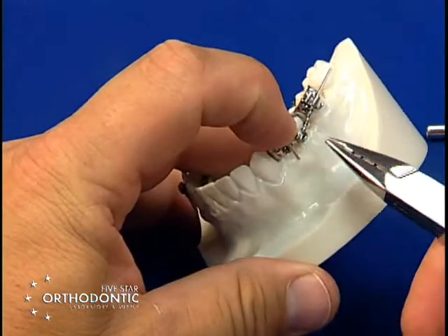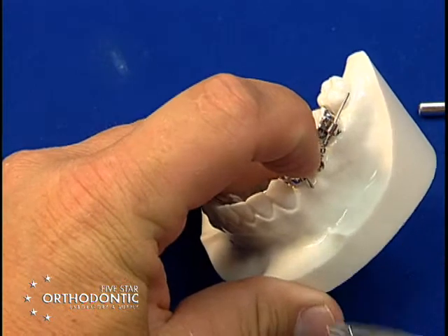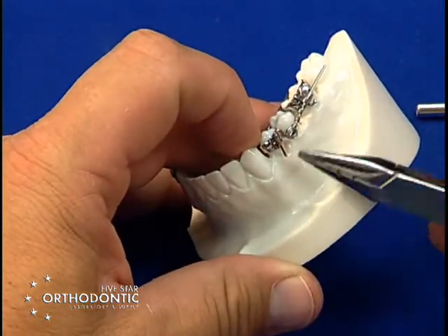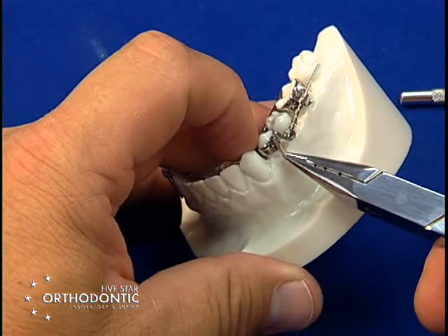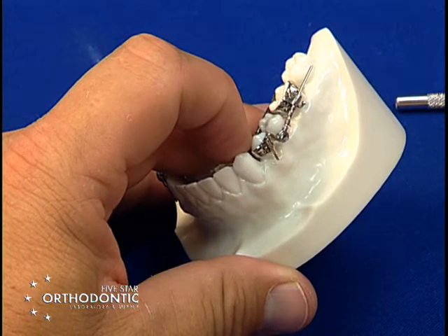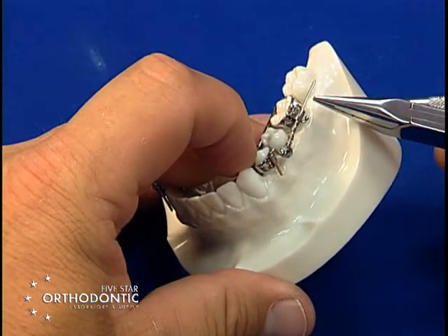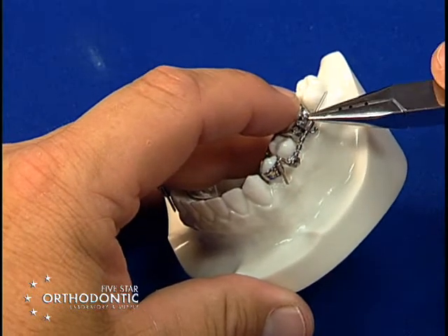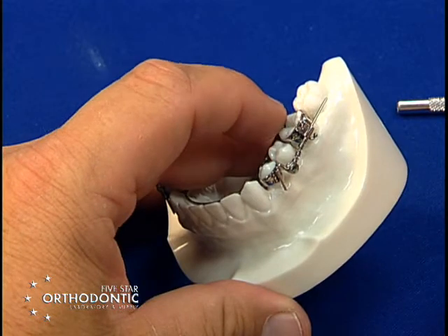Once the appliance is in, you can take a Jeraback plier, place a slight bend on the wire, which will keep it from coming out of the hollow tube. After you make the bend, you can shorten the wire. Do not shorten the wire before you make the bend, because it makes it very difficult to put the bend in the wire. Also, you have a distal extension coming out of the back. You need to leave it as long as possible for guidance to drive the molar back.